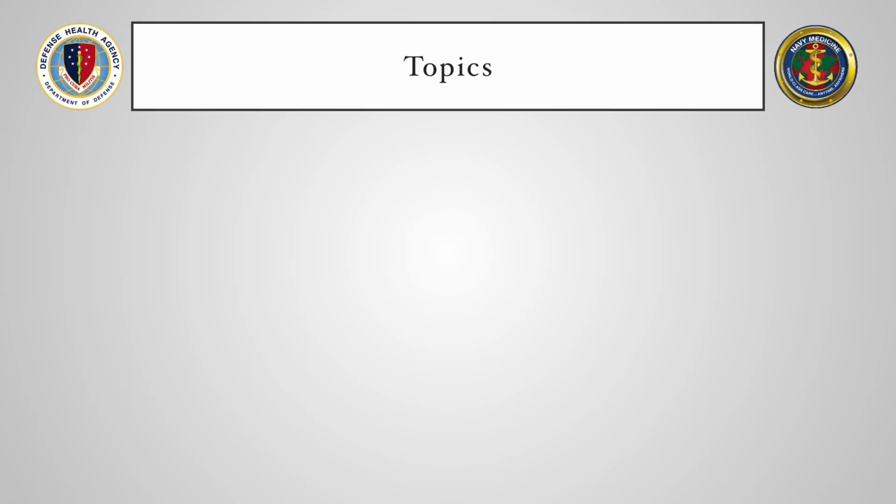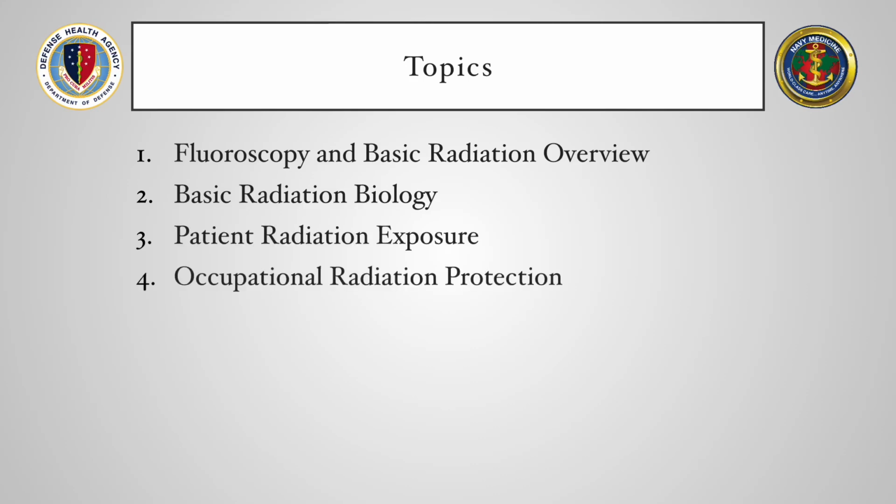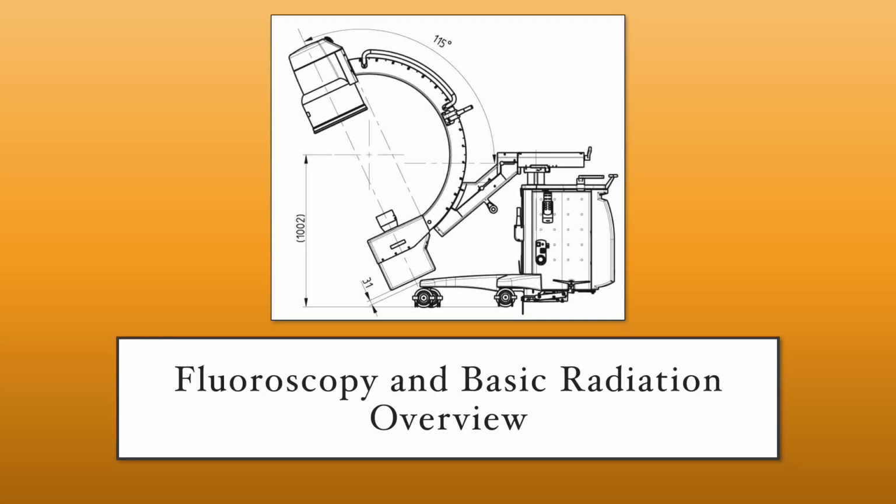Today's training is divided into 4 topics: a fluoroscopy and basic radiation overview, basic radiation biology, patient radiation exposure, and occupational radiation protection. Fluoroscopy is the continuous acquisition of a sequence of X-ray images over time, essentially real-time X-ray of the patient. Modern general-purpose X-ray uses a pulsed X-ray beam in conjunction with digital image acquisition.